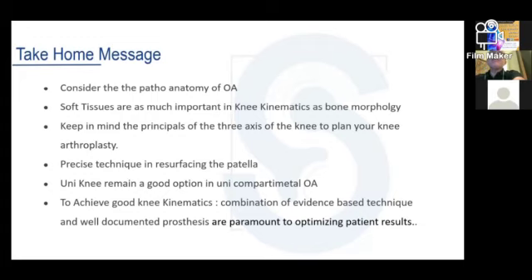In difficult cases, if you had an arthrodesis of the knee, for example, there are very difficult cases. It is very difficult to bring back the different axes, and you have to plan it. I use computer-assisted surgery today for these very difficult cases or very big deformities. But computer-assisted surgery should be used by people who have already done a lot of types of arthroplasty, because if you lose the computer midway through your surgery, you cannot stop.